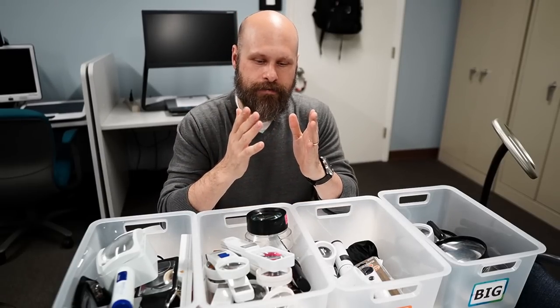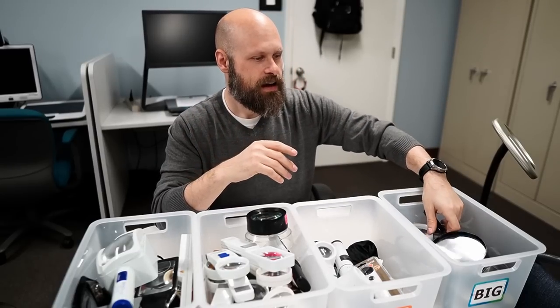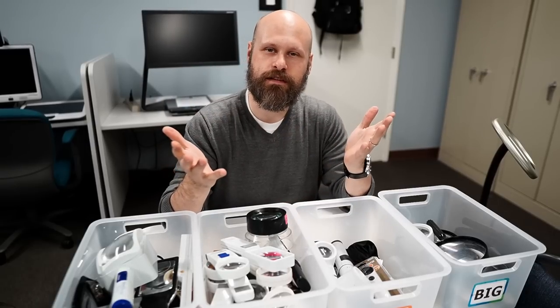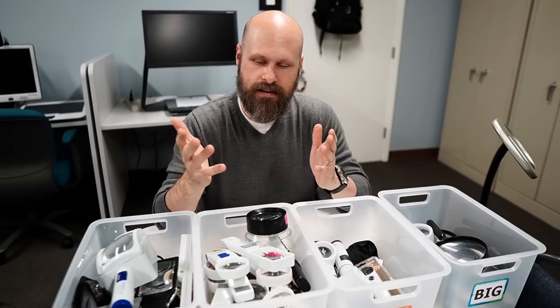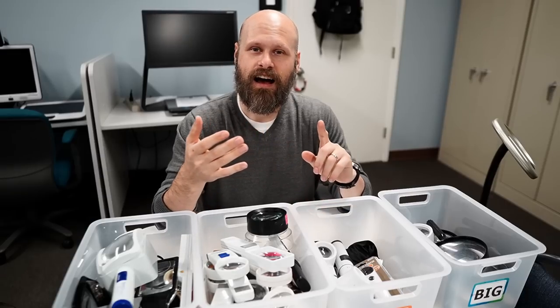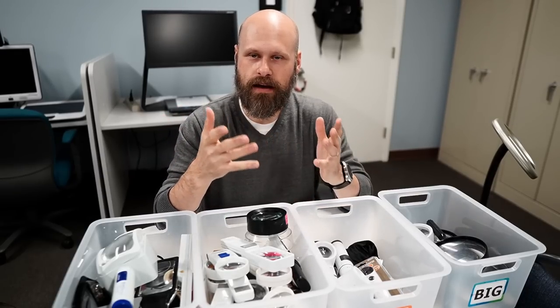If you need a stronger magnifier, you're going to have to deal with a much smaller lens. That's why I say that the large magnifiers you can buy at stores like Walmart or Target, chances are for most people watching this video, they're not going to be strong enough. You're going to need to go somewhere like Amazon, Maxi AIDS, or LS&S to get a quality magnifier that's going to work best for you.